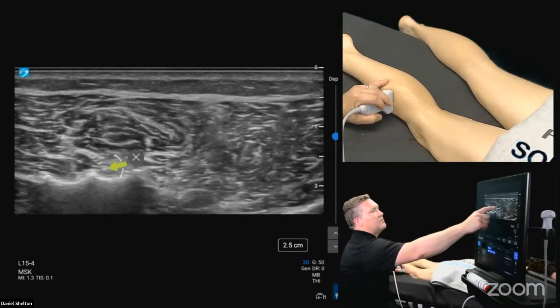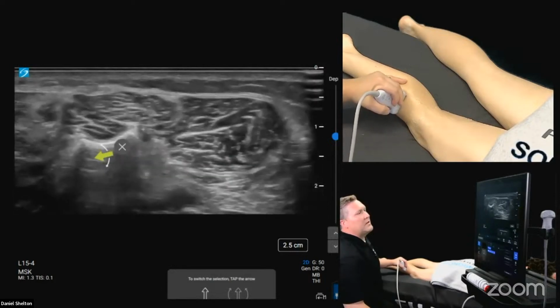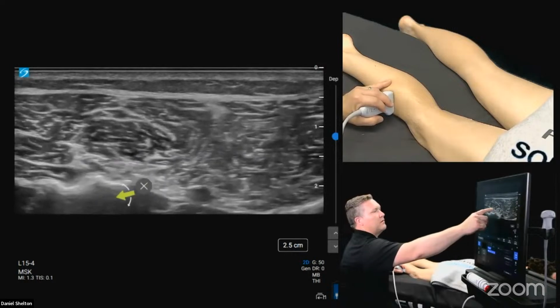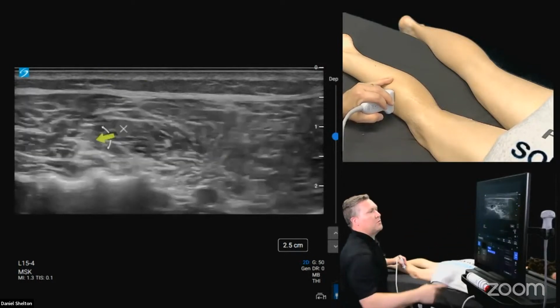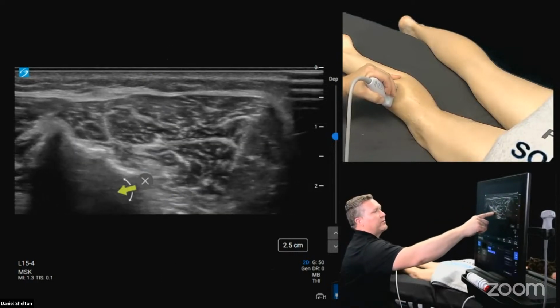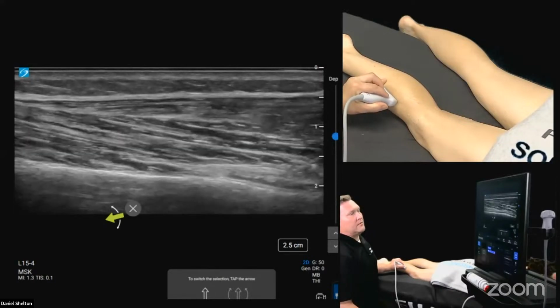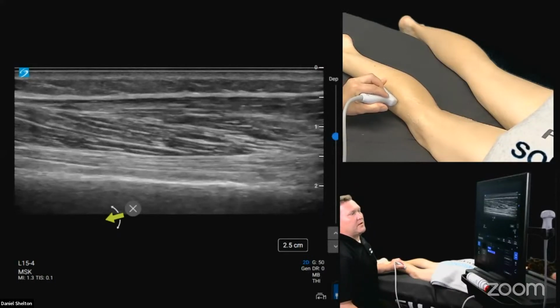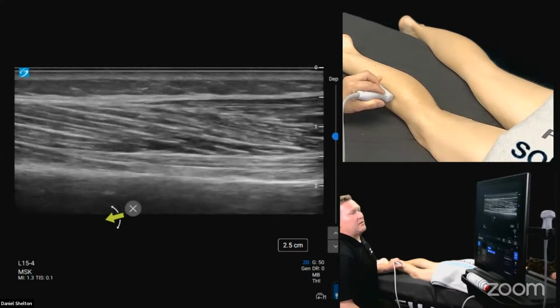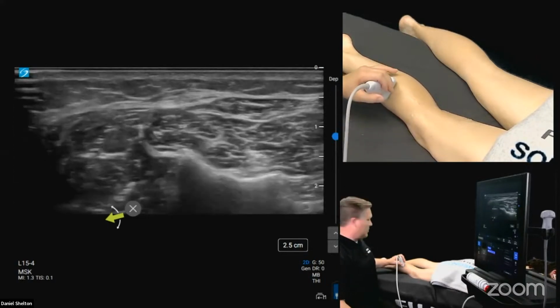Did you see the angle I had to do on the video to match the nerve as it traversed? Really, you want to keep it pinned between a bony backboard. So what I mean by that is I have a bone here, the nerve here, and the transducer all in line. What you don't want to do is have this oblique angle where you're taking a long axis shot of the nerve with no skeletal reference point, if you can afford it. So in long axis, this is what the nerve would look like because we have that nice skeletal reference point behind it, which is fibula. So catching the right angle can really put the nerve into context where it is on the body. So we really made our way down the screen and almost off the camera there.